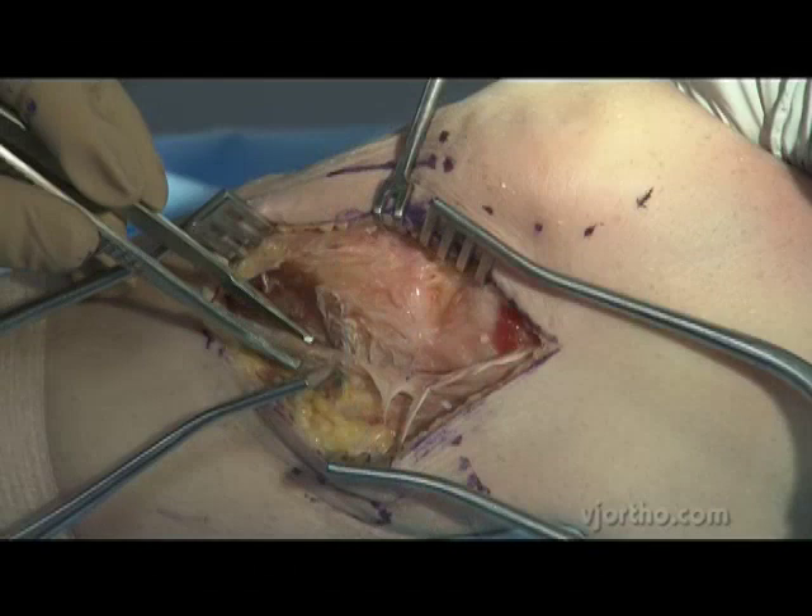We wanted a material that would be very resistant to compressive loads but still within a physiologic range of load, and then the holy grail would be a material that would be absorbed or replaced by normal cancellous bone.